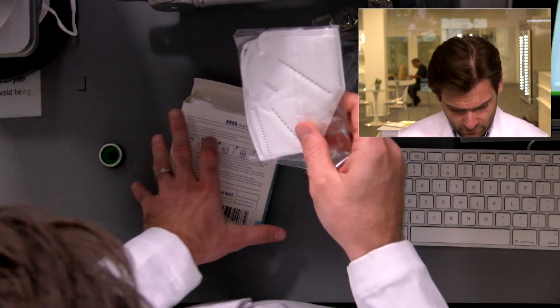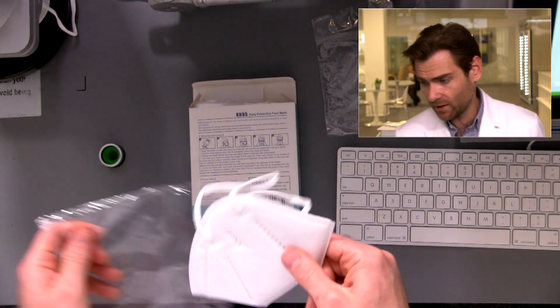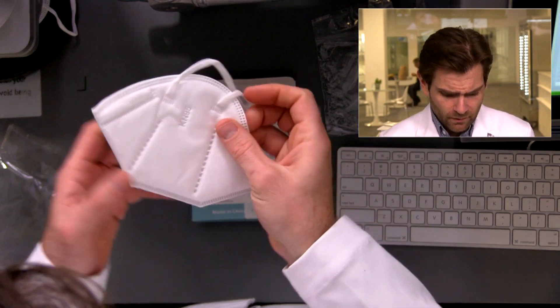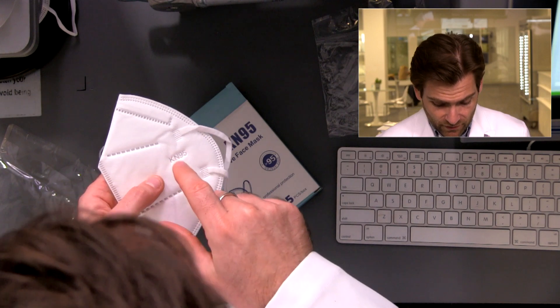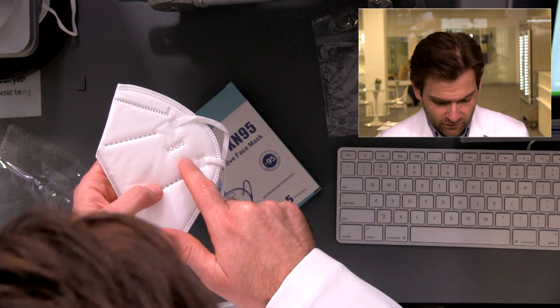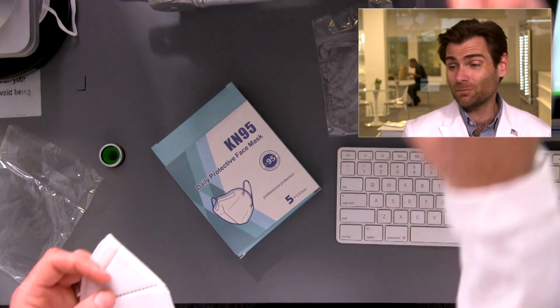There are only five masks in here — not very many. It's a very fluffy mask. Here's why I don't think it's an actual KN95 — though that doesn't mean it won't test well. Real KN95s have to have the brand name, the model number, and 'GB2626' printed on the front of the mask itself. This one doesn't have that — it just says 'KN95.'